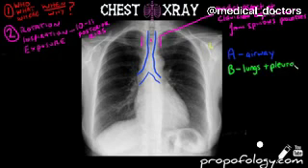Moving on to B, you're going to trace the lung fields, look at the pleural spaces as well. You're going to have a look and see if the lung markings go all the way to the lateral or the side aspect of the rib cage. And you're going to make sure there's no collections in the distal portions. You're going to make sure there's no collapse of any segments of the lungs.